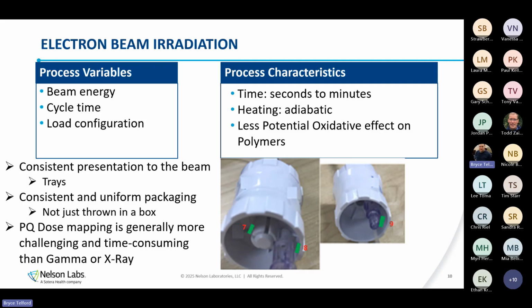That's what we refer to as our minimum sterilization dose exposure or sterilization exposure. We also have our testing exposures. So this is where we're exposing to our verification dose at that lower sterility assurance level. Well, for gamma, generally we don't need a dose map because it's not as sensitive for that verification dosing.